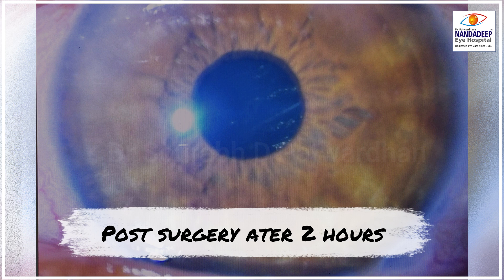The cornea, as you can see, is crystal clear. I must emphasize you must use a good dispersive OVD to protect the endothelium for this technique. But I think you should try it, because it makes things much simpler, much faster, as well as safer for the patient. Thank you.